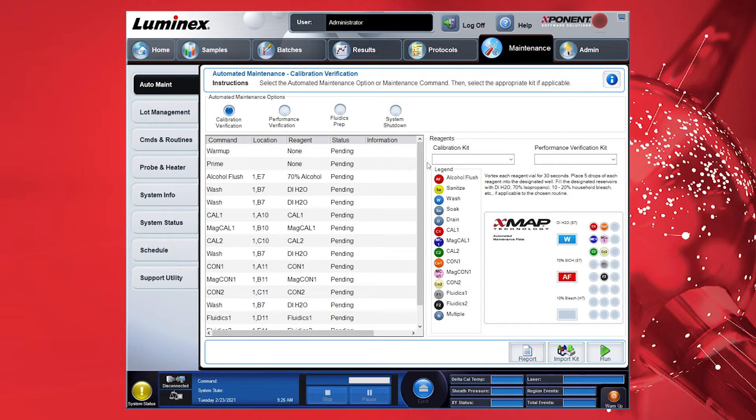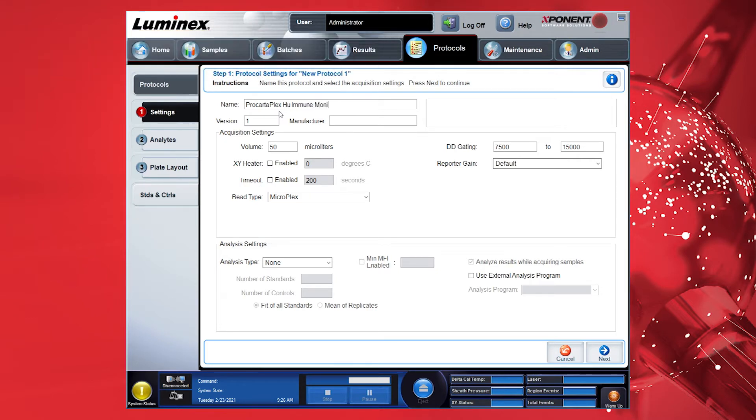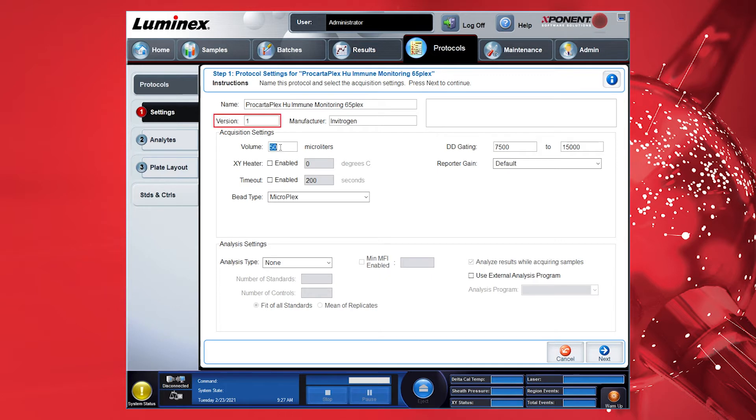For setting up a protocol, go to the Protocols tab and select Create New Protocol. Fill in your preferred name. As an example, use ProCartoPlex Human Immune Monitoring 65 Plex. Fill in Manufacturer as Invitrogen. The version number is set by default to 1. If you wish to edit an existing protocol, the software will require you to change the version number in order to save the changes.